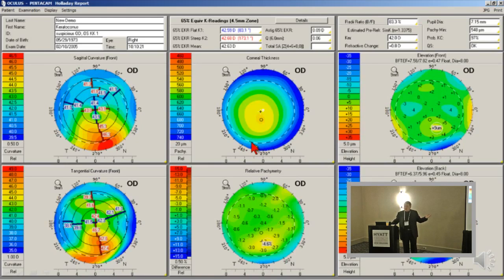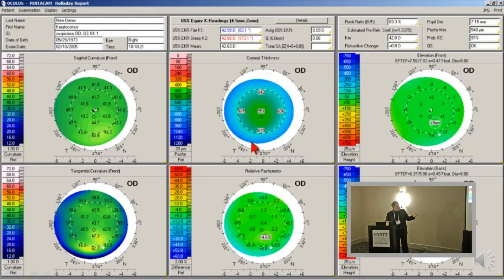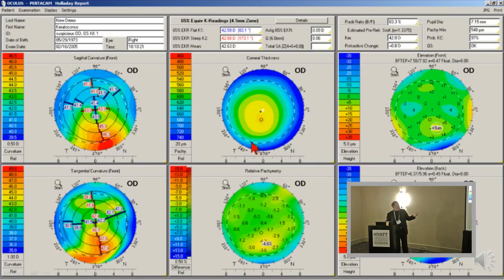That's the same map. Here's the map with what the guy sent me. And here's the map with the Holladay settings. Okay, it's night and day. Well, now it doesn't take a genius to say, there's something wrong with this. Okay, and when you look at it, we're going through the details on these, but the point is that now the setting comes up exactly that way, and there's nothing you can do about it.